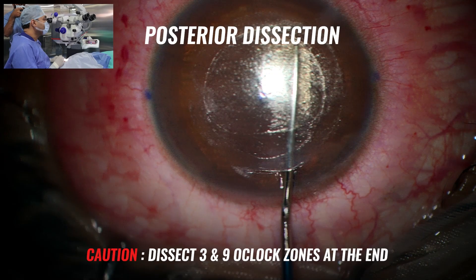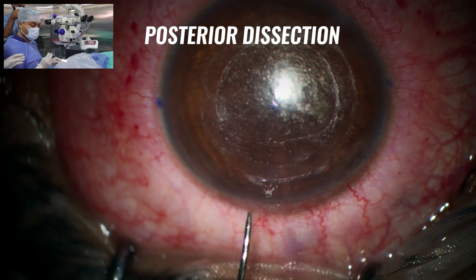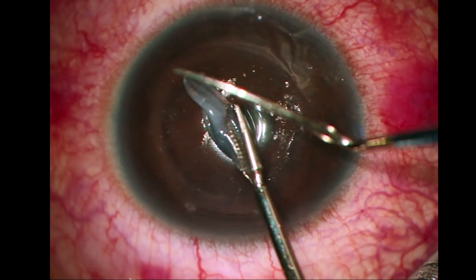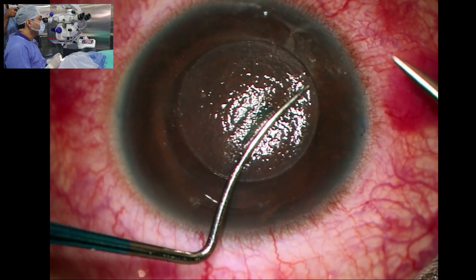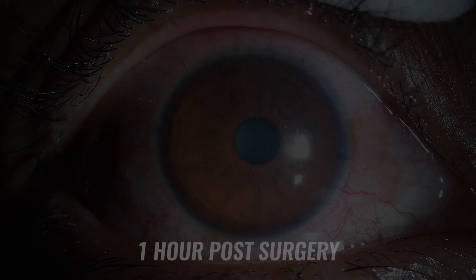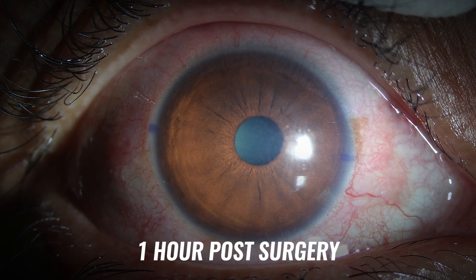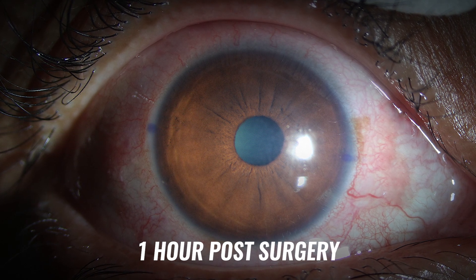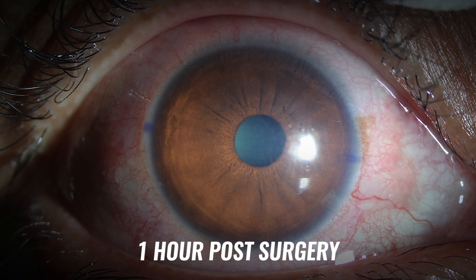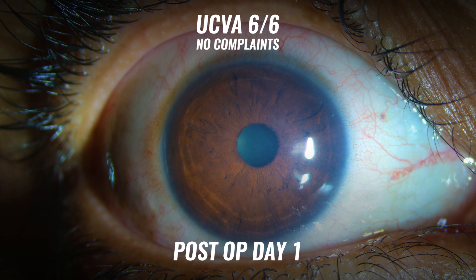Dissection at three and nine o'clock should be left for the end. The dissection is then completed and, using forceps, the lenticule is completely taken off and examined to see if it has come out in total and if there are any remnants left behind. I thank my OT team and also the team from J&J Elita and the scientists and researchers for making such a smooth, silk-like lenticule procedure, which gives patients so much wow and happiness from day one. Thank you.